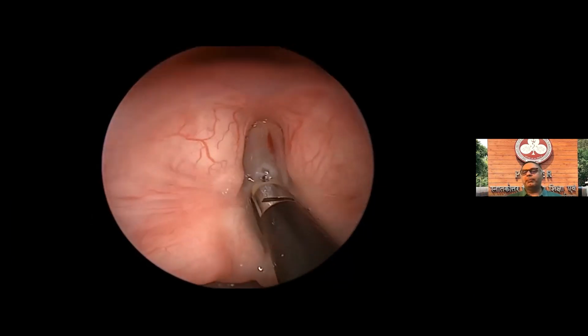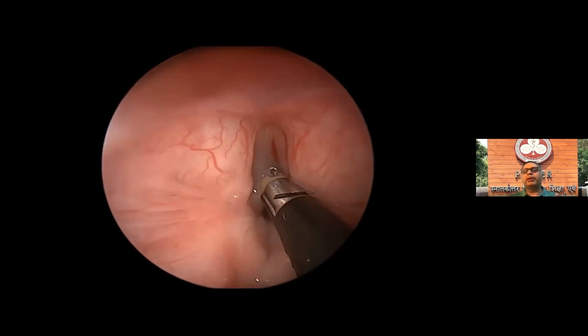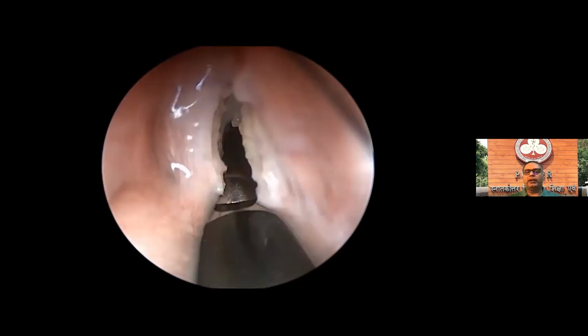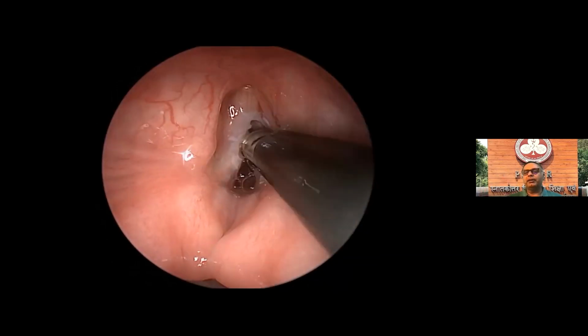So again, using a microlaryngeal wand, you cannot use a bigger wand here because of the collateral spread of plasma, which will form. It is more circumferential. You don't want that. And the patient had a bifid epiglottis also. So make sure there is nothing lower down. Check for any tracheal stenosis, which can be there.